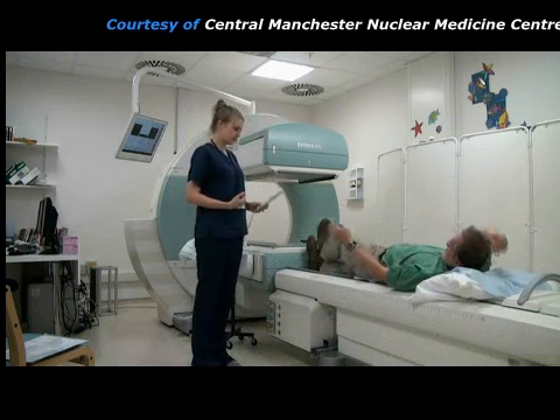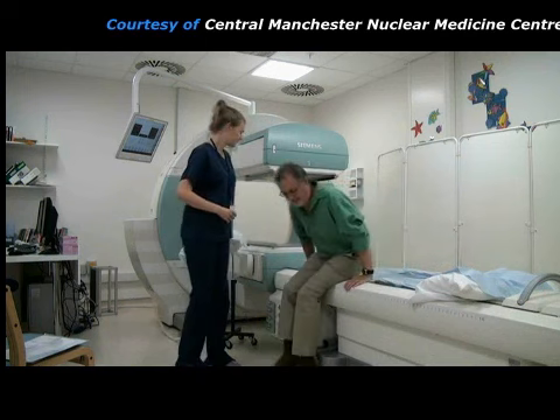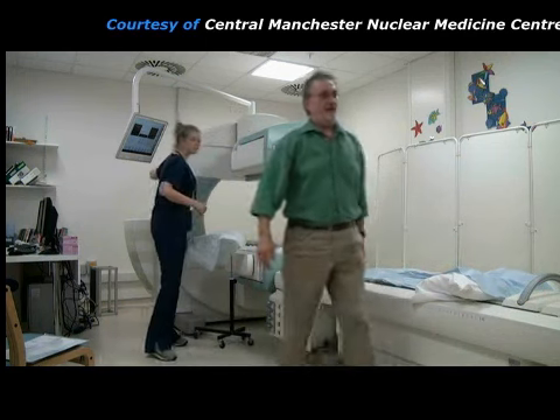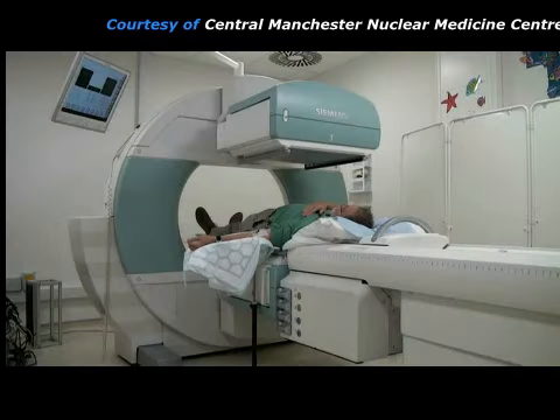The patient's bladder will now be full of radioactive urine so he is asked to go to the toilet to empty his bladder. After emptying his bladder, the patient is repositioned in front of the gamma camera for a final picture of his kidneys.